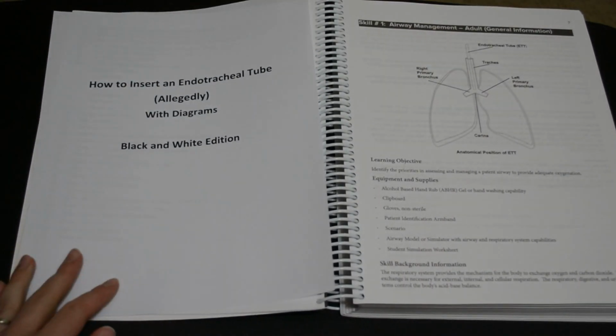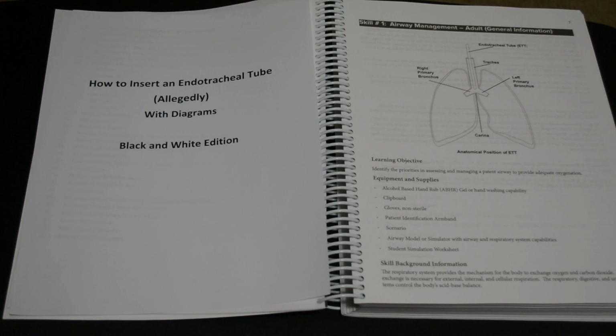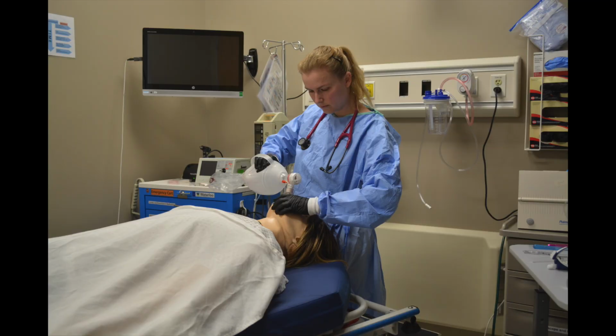How to insert an endotracheal tube, with diagrams, black and white edition. Make sure the patient is being ventilated by bag mask as you prepare.